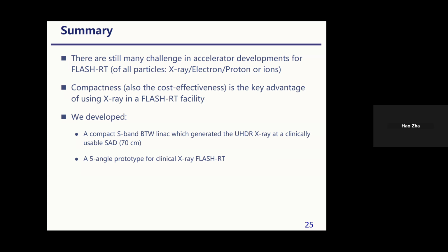But we believe that compactness and cost effectiveness are the key advantages if we use X-rays. Just like nowadays, the mainstream of conventional flash, we choose X-rays. So I believe in the future, if we upgrade to flash radiotherapy, X-rays will still be the mainstream.